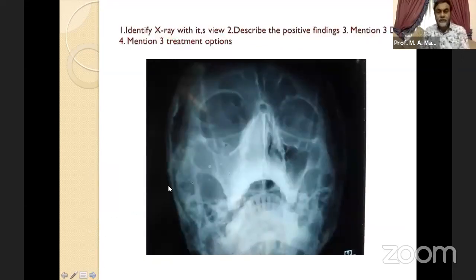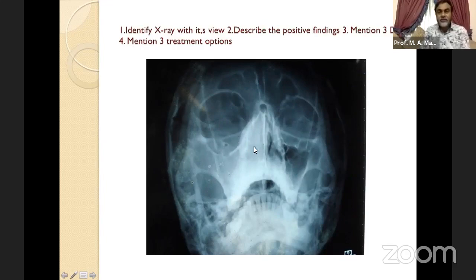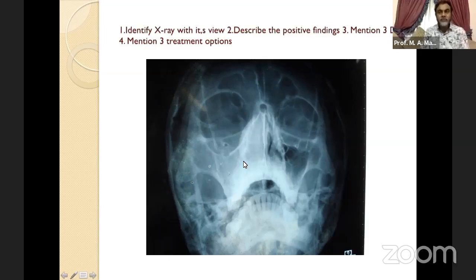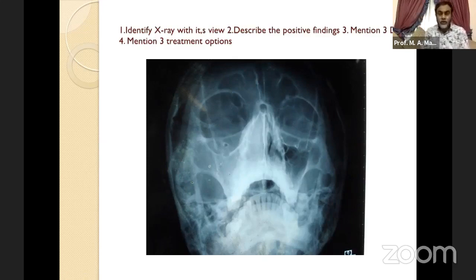This is another important X-ray: X-ray paranasal sinuses, occipitomental view, showing haziness in the right maxillary sinus as well as a soft tissue shadow in the right nasal cavity — the right nasal cavity as well as the right maxillary sinus is completely opaque. Other sinuses are normal. My diagnosis: right-sided antrochoanal polyp, because antrochoanal polyp originates from the maxillary sinus, fills the nasal cavity, and extends to the nasopharynx. Always mention the side.